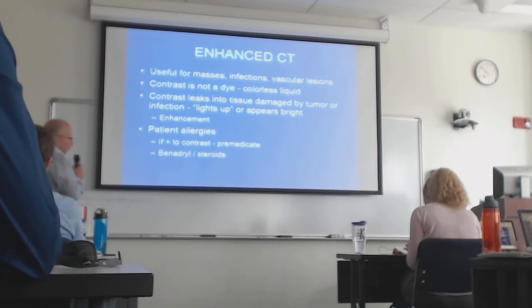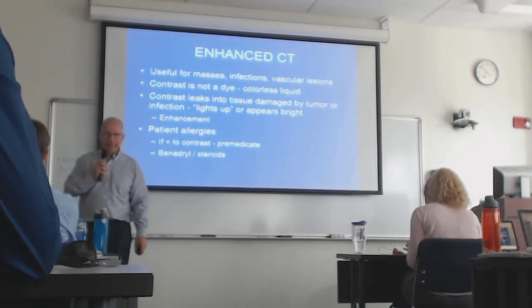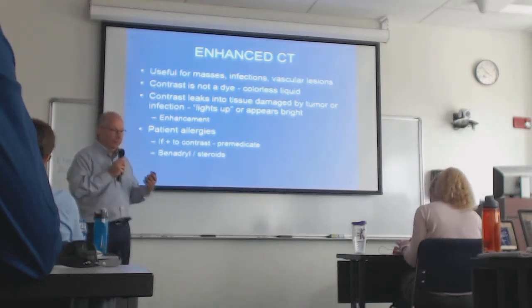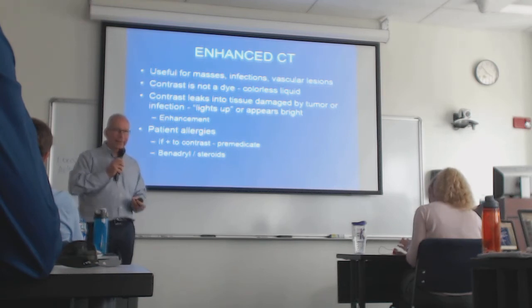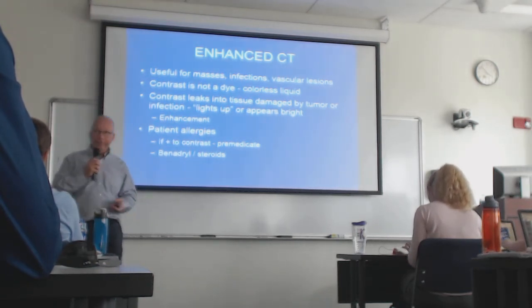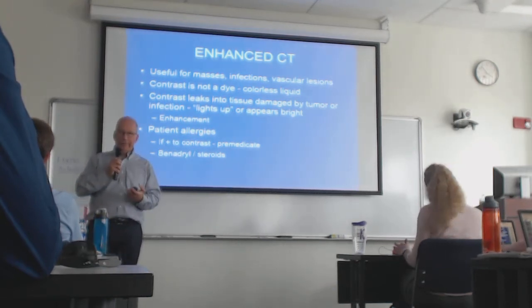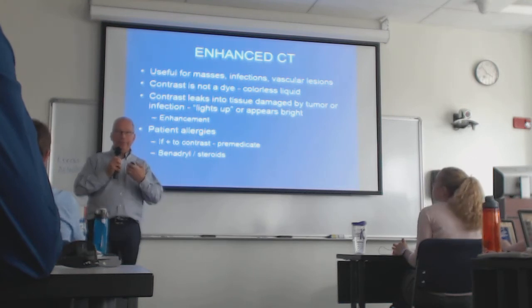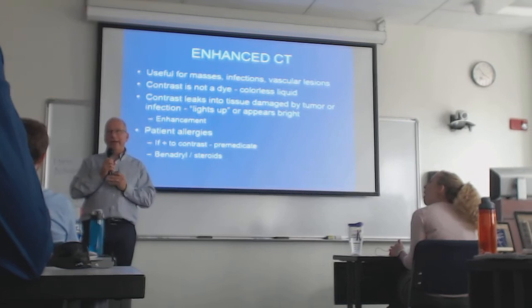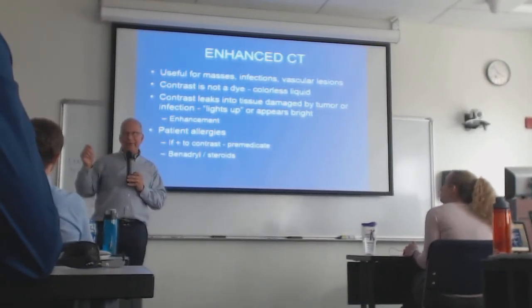All right, let's talk a little bit about the use of IV contrast. IV contrast is basically a clear, colorless, odorless liquid, but that liquid has a high iodine content in it. If you inject it intravenously, you are increasing the amount of iodine that gets into the blood vessels, or whatever the blood vessels are feeding, and iodine is very radiodense.